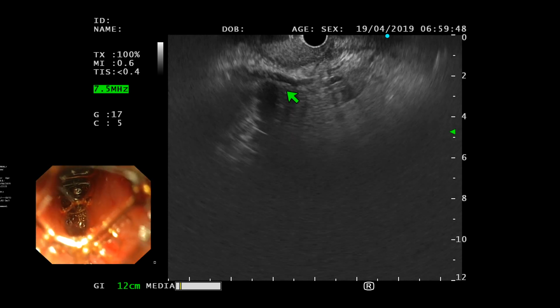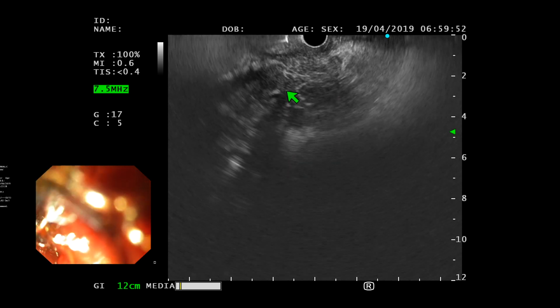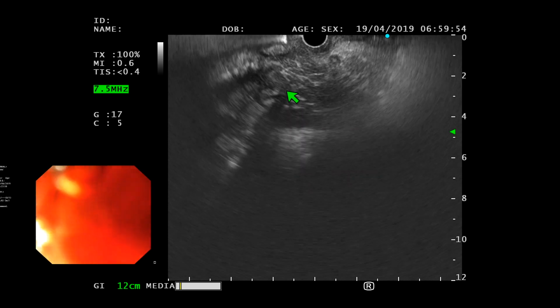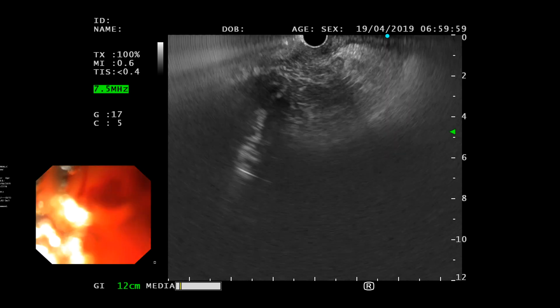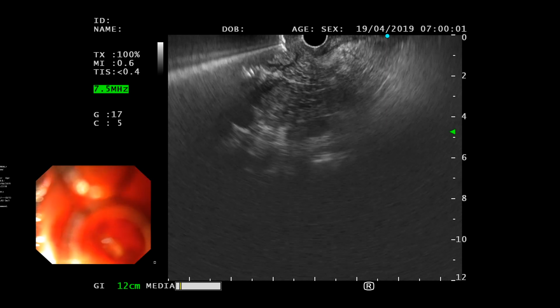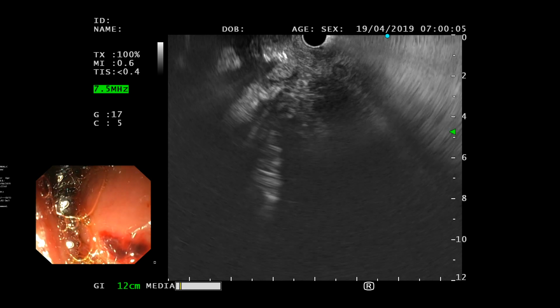हाँ जी, कैसा है मटेरियल? चलो ठीक है, ओके फाइन. हाँ जी, are you good? हो गया एडिक्वेट है कि दोबारा करना होगा? नहीं, वो तो करना है, 2 या 3 पासेस तो करने हैं.